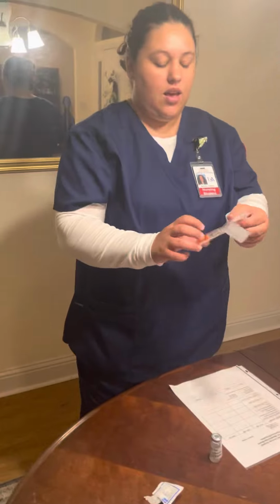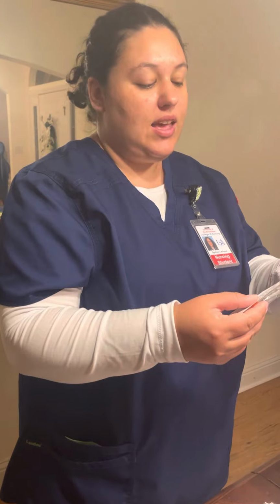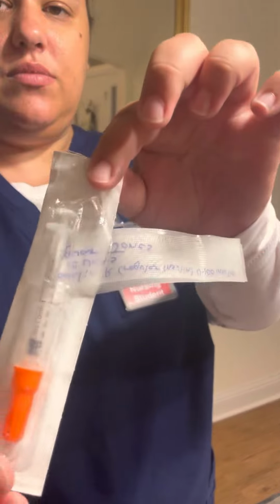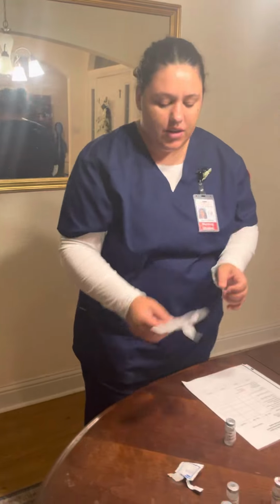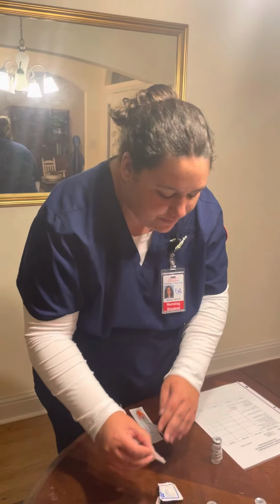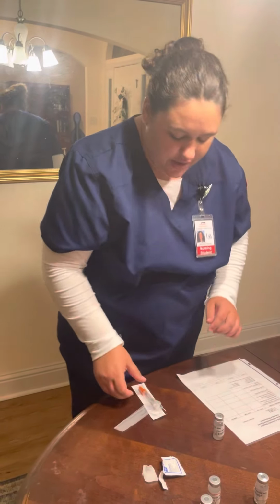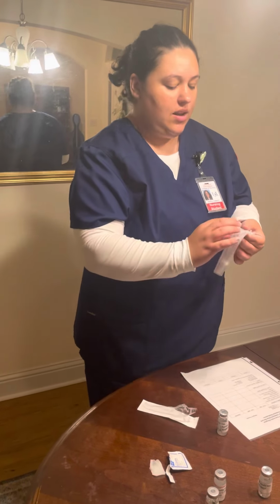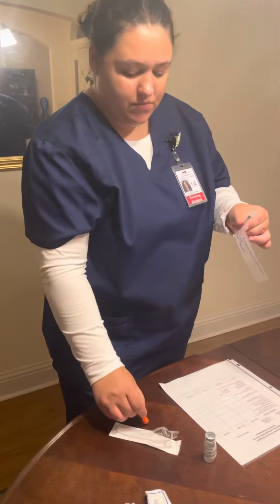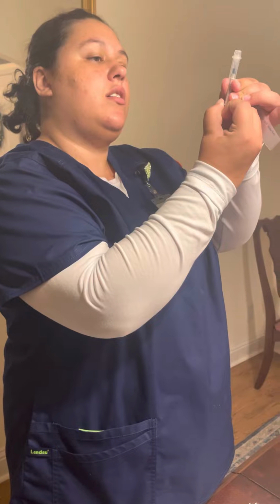All right. Now I need 10 units subcutaneously. So I have my 1/2 milliliter insulin safety syringe with a 29 gauge 1/2 inch long needle. The first thing I'm going to do is take my alcohol pad, clean the top, dispose of it, take my insulin needle, take it out, do 10 units of air.